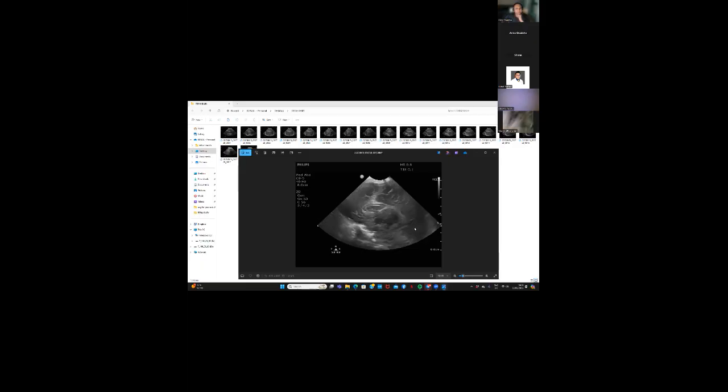Then going back towards the mid sagittal, towards the left side. On the left side, I made multiple attempts, I tried for almost 5 to 7 minutes. I was not able to get a good view showing exactly the choroid and the caudothalamic groove. The best I could get was this one, which again just raises the possibility that you may have an element of cerebral edema. Here you've definitely got the caudothalamic notch with a little bit of choroid lip. Well done. My compliments for persevering. It can be quite tricky.